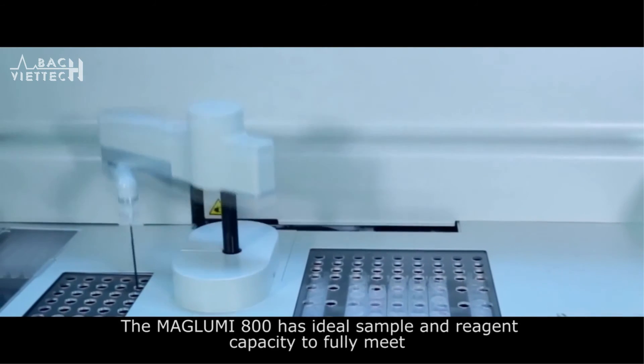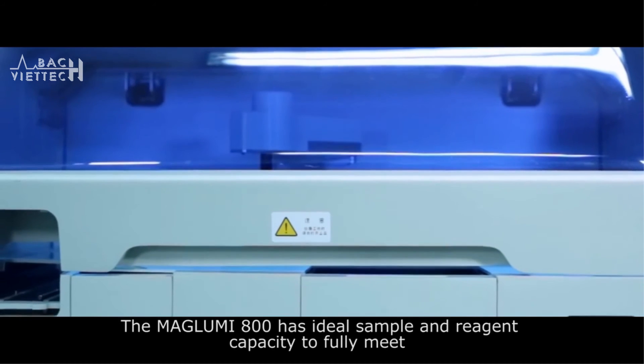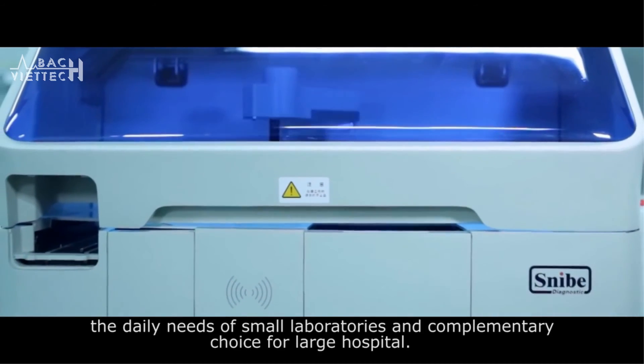The MAGLUMI 800 has ideal sample and reagent capacity to fully meet the daily needs of small laboratories and as a complementary system for large hospitals.